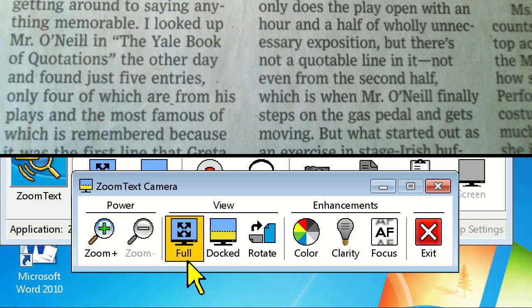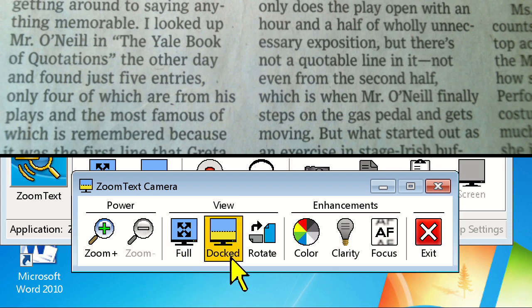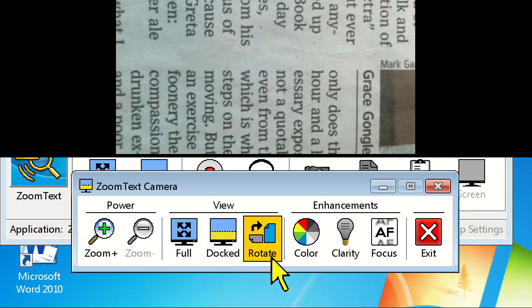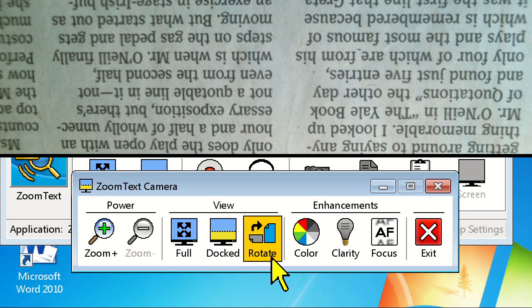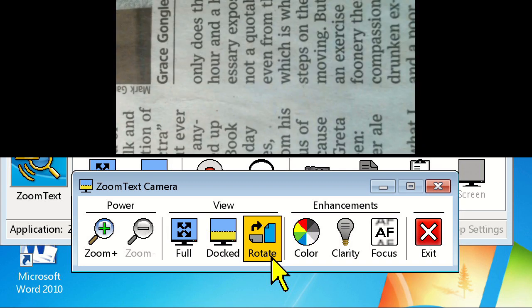If you have a document under your camera that's upside down or sideways, you can always move the sheet of paper under the camera manually, or you could simply click the Rotate button and rotate the camera image 90 degrees clockwise.